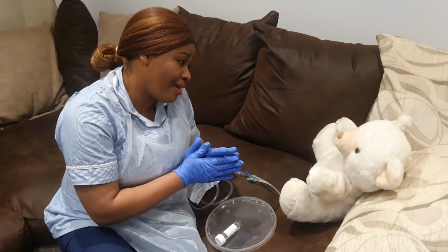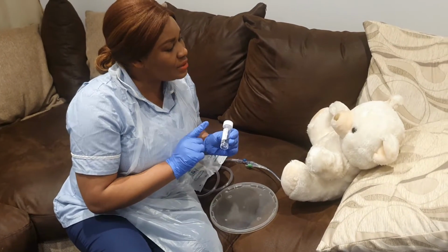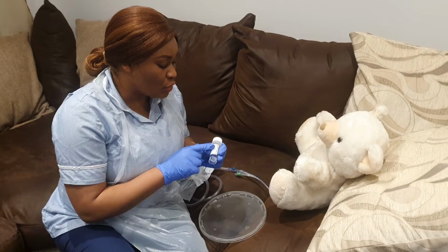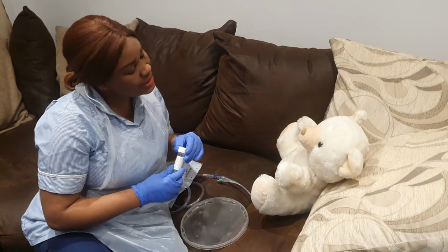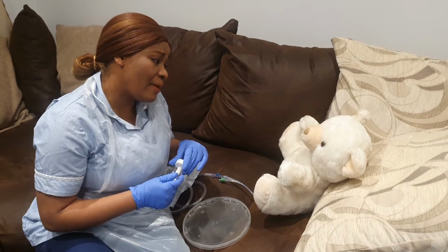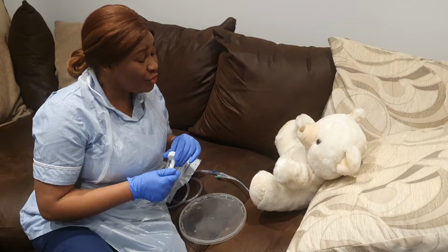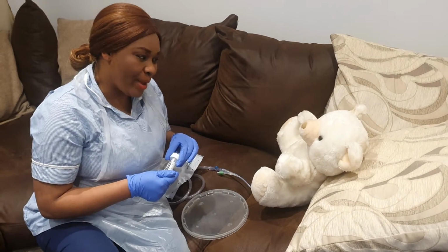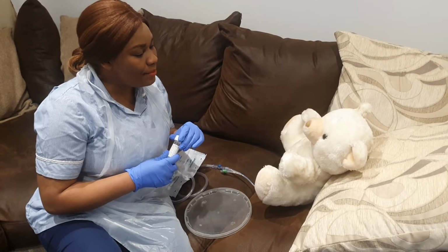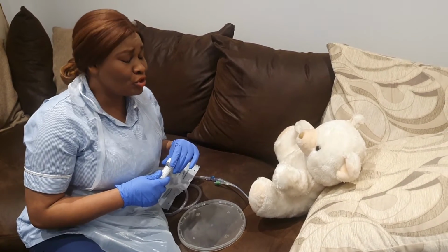Are you okay? Yeah, I'm okay. So what I'm going to do, I'm going to label this urine sample I've collected. I'm going to write your name, surname, hospital number, and ward. It's all written there, and I will send it to the lab. Is that okay? Okay. Do you have any concerns for me, my lovely lady? No. You have no concerns. That's perfect. So I'll leave you with the call bell there, and I'll send your sample of urine to the lab. Is that okay? Yes, thank you so much, darling.